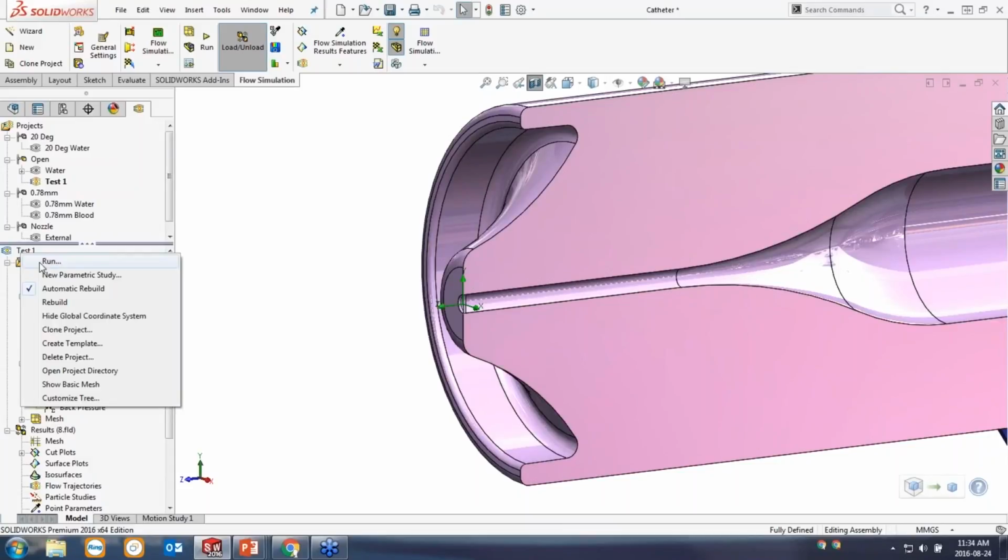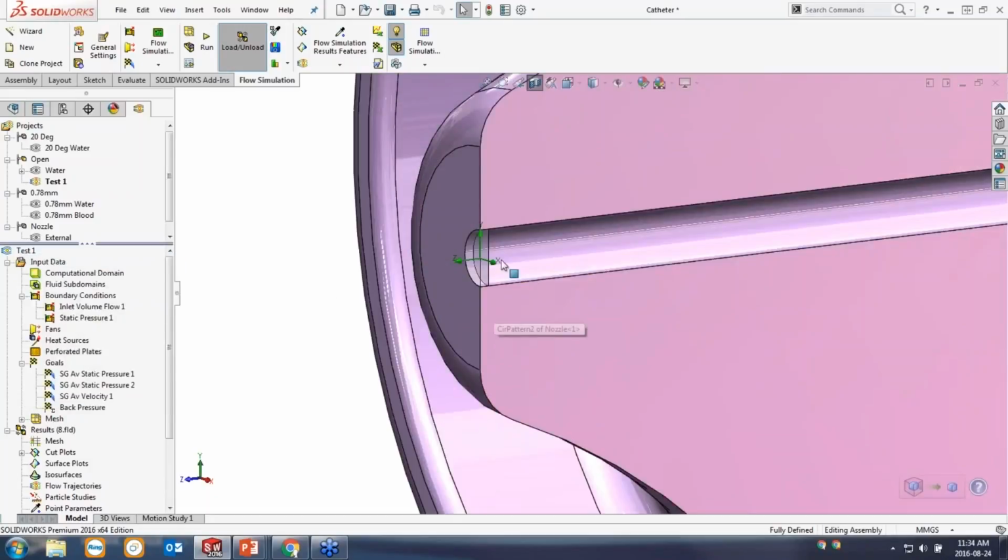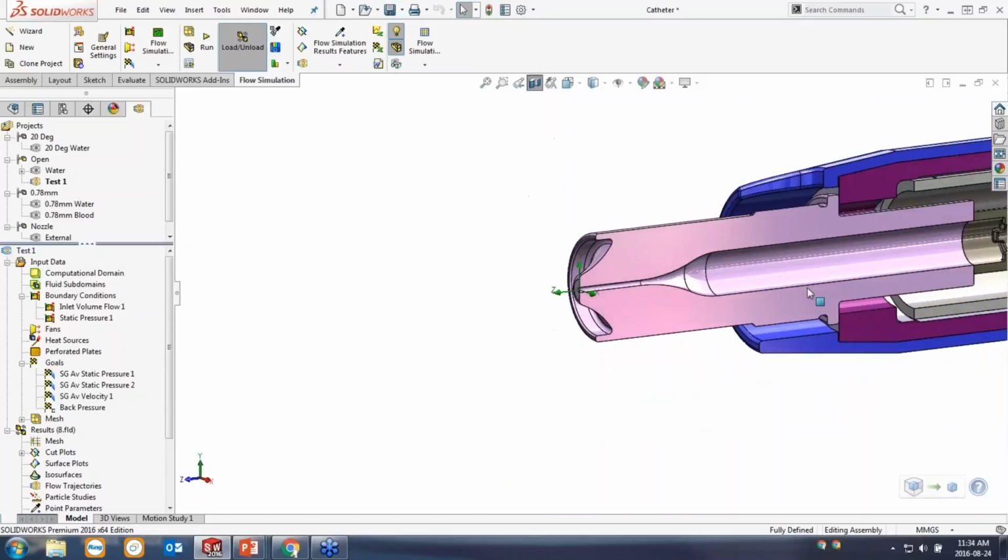Now, I've got another question come in here, again asking about mesh size. Does it need to be smaller than the nozzle diameter? Absolutely. You're going to want to have several mesh elements across the diameter of the nozzle in order to accurately capture the behavior through that nozzle. Luckily, right now, I'm using the default settings for my mesh, which is going to be intelligent. It's going to automatically increase or decrease the size of the mesh based on the geometry. We don't have to have a constant mesh size, and in fact you wouldn't want to have a constant mesh size, and the software is taking care of that for me right now. That's all the detail I'll get into for the moment, but we can definitely come back and talk about meshing in more detail later on.